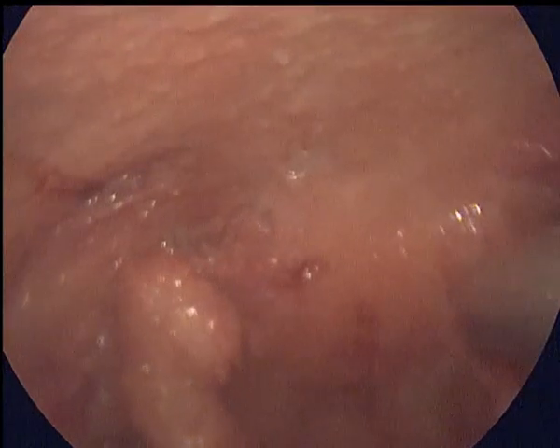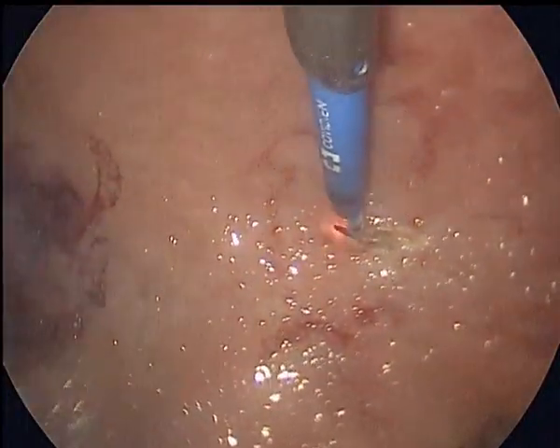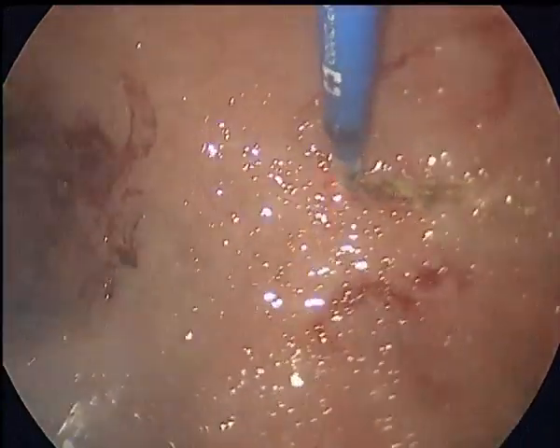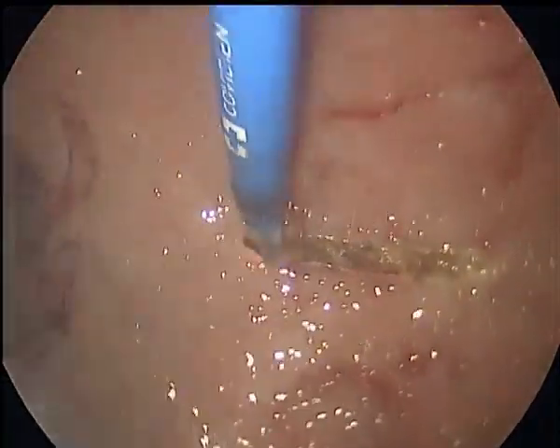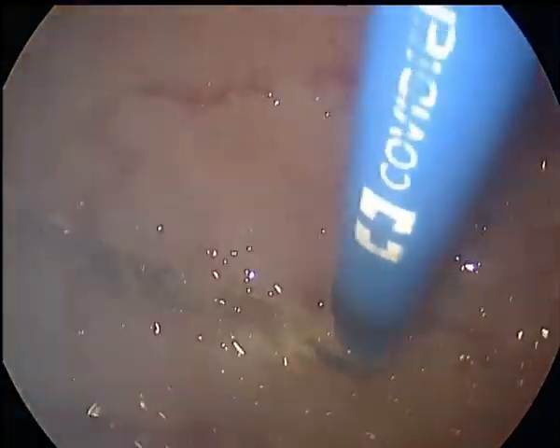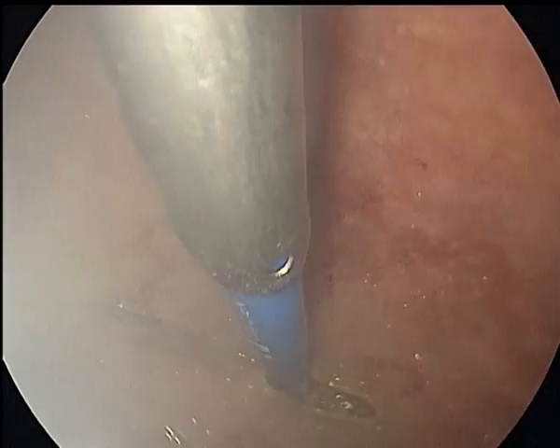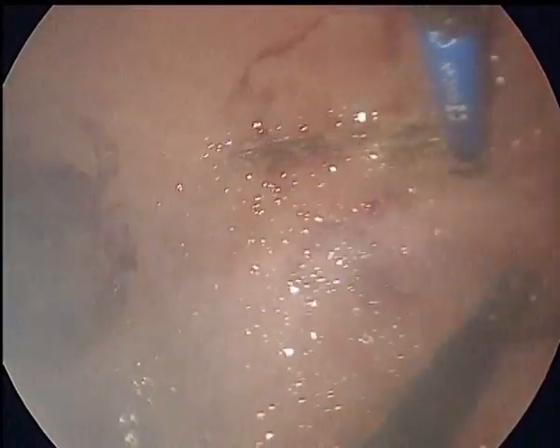Now we proceeded with biopsy after that. So we take a biopsy from the parietal peritoneum. In this type of cases we usually take a large chunk of tissue to get a good tissue diagnosis. So we take approximately 2 to 3 centimeters of tissue to get this biopsy specimen.